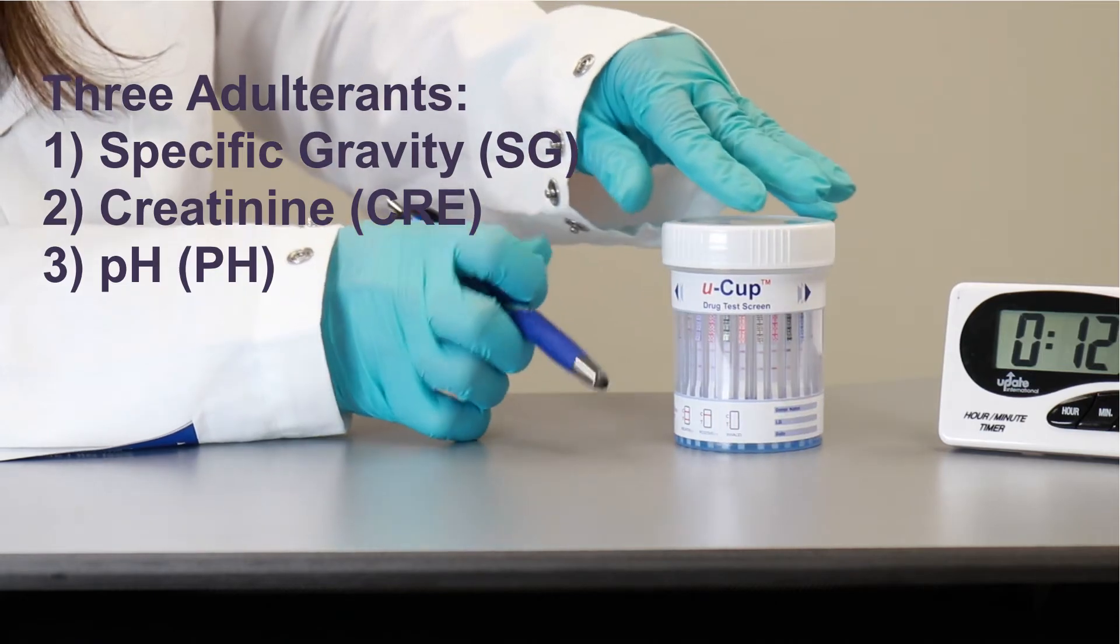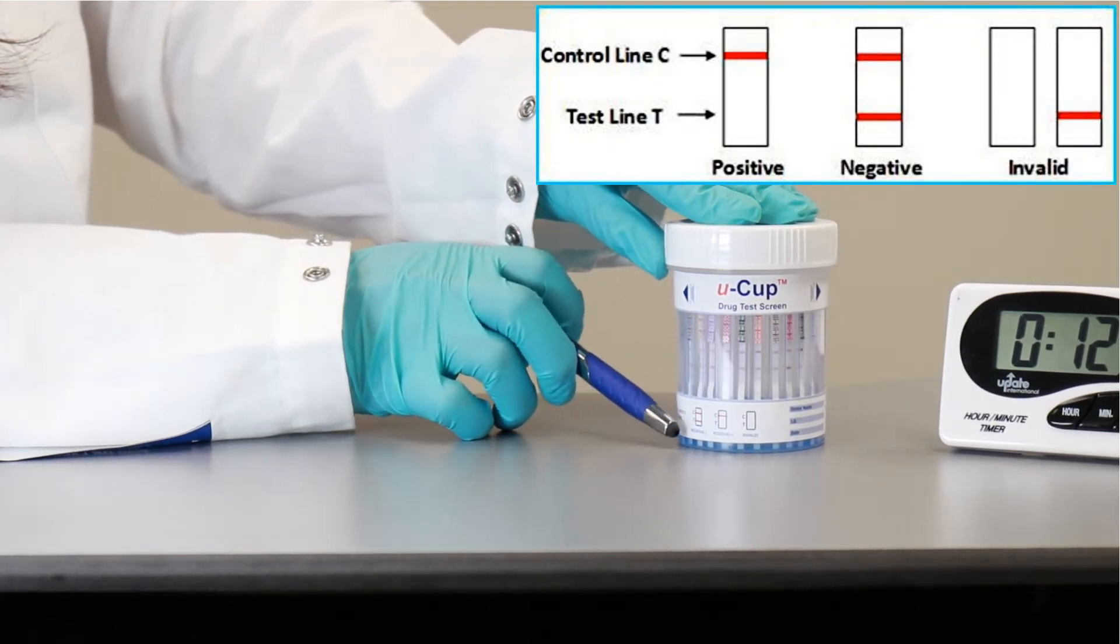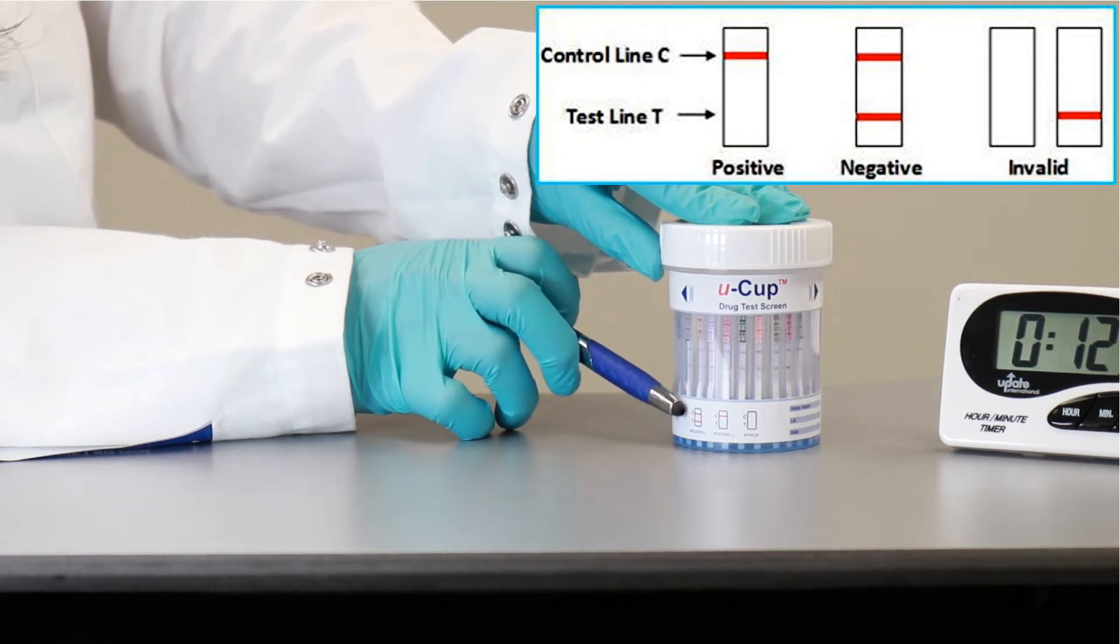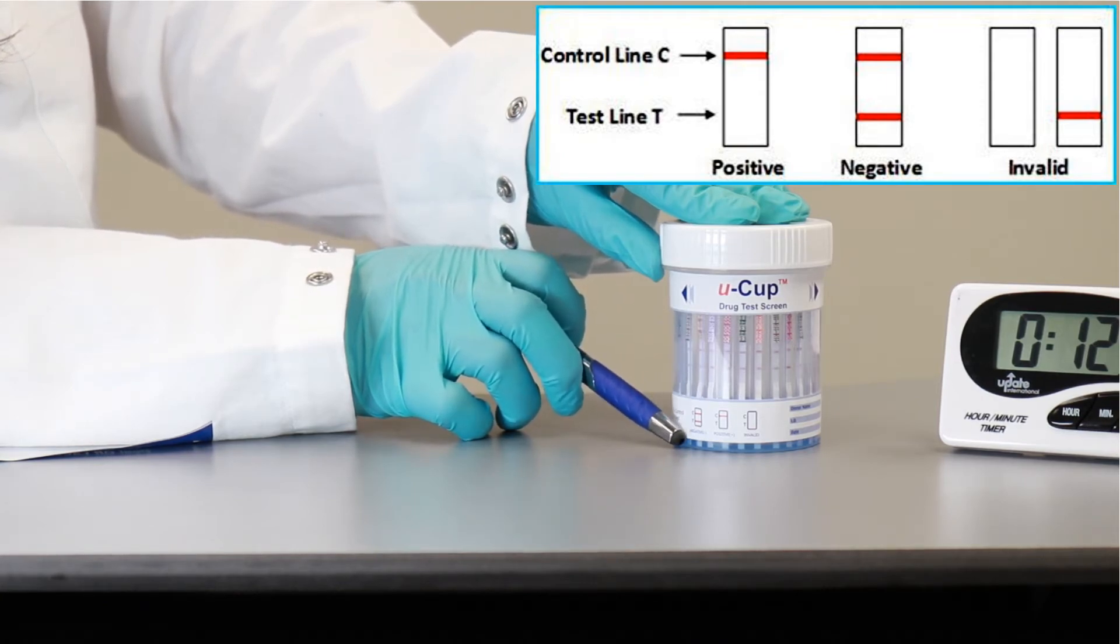So I can see here in the test line window, you have a negative where you have two lines, a test line and a control line. So if both of the control and test lines are present, the result is negative.